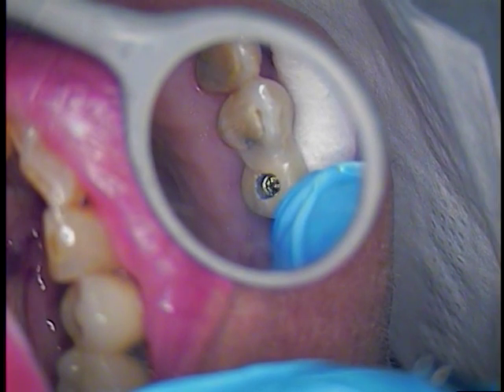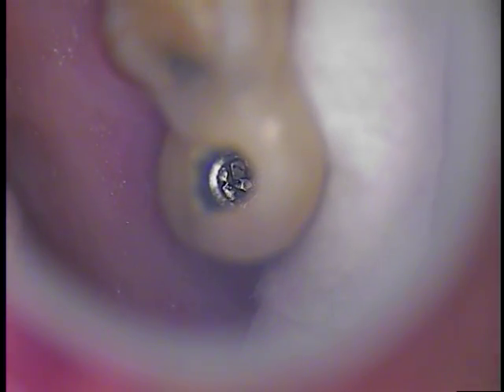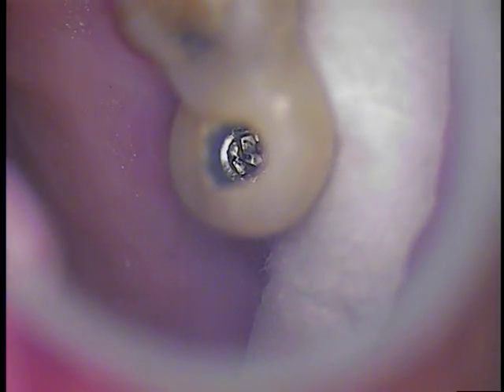So, the screw — the base of the screw head looks like there's some kind of a welded portion. But it looks like it's in the shape of a hex. Actually, a square.